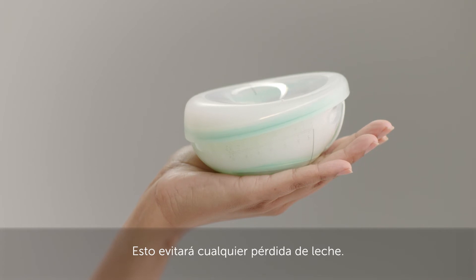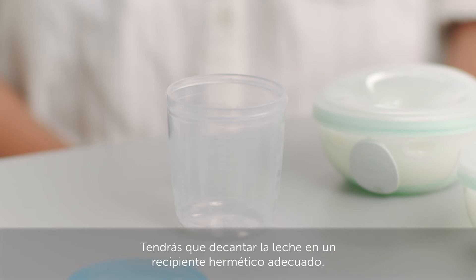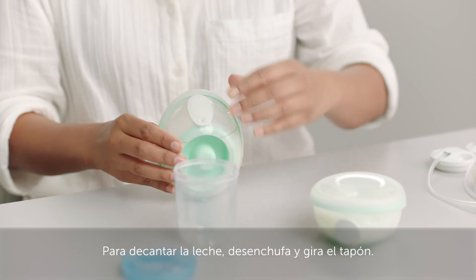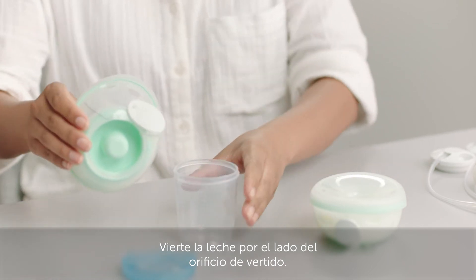This will prevent any milk loss. Make sure the nipple tunnel is facing up if you lay it flat. You'll need to decant your milk into a suitable sealed container. To decant your milk, unplug and rotate the stopper, then pour the milk out through the side of the pour hole.